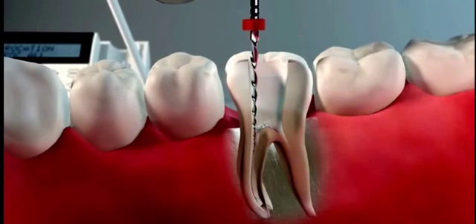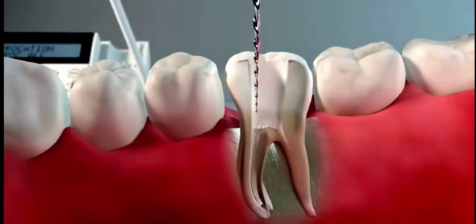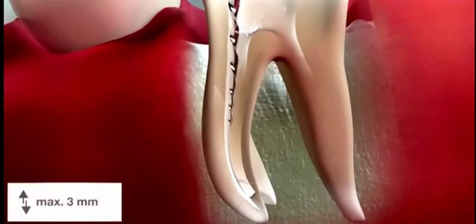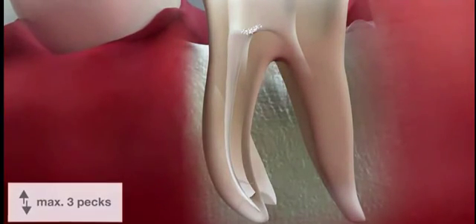Move the instrument in a slow, in-and-out pecking motion. It is important that very little pressure is applied apically. You will immediately feel that the instrument advances easily in the canal. Make sure that the amplitude of the movement does not exceed 3 mm and that you make only three consecutive pecks.